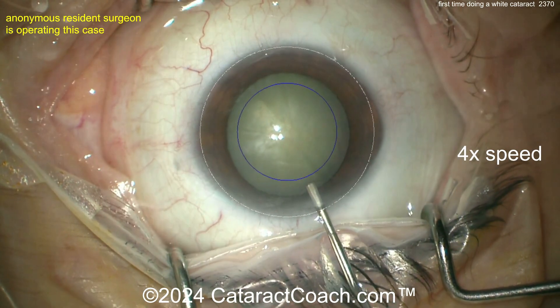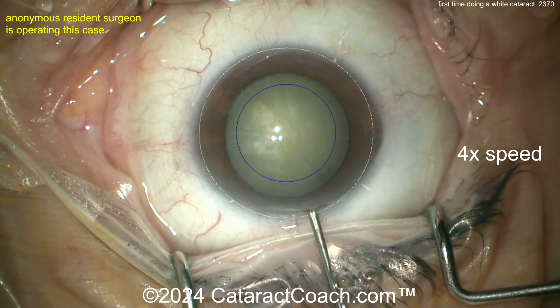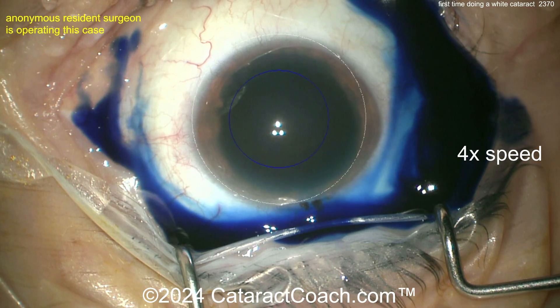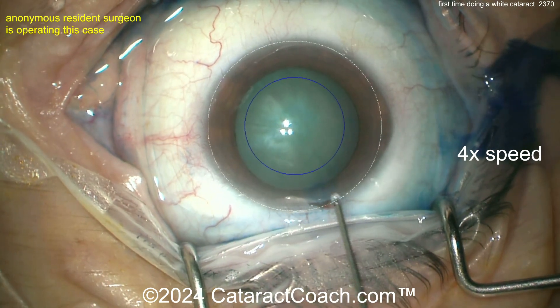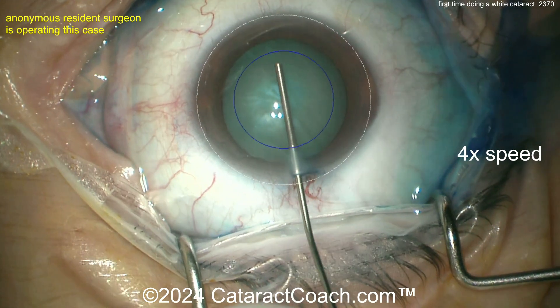There's fancy equipment here with a video overlay showing a guide for the capsulorhexis. Draping is good, eye in primary position. Trypan blue dye going in. You can see this heads-up overlay built into the microscope that gives you an outline of where you want that 5 to 5.5 millimeter rhexis.